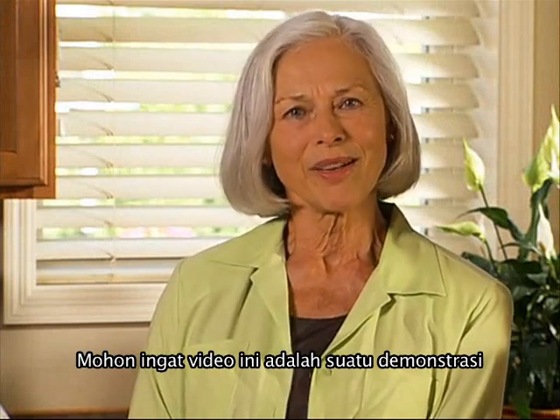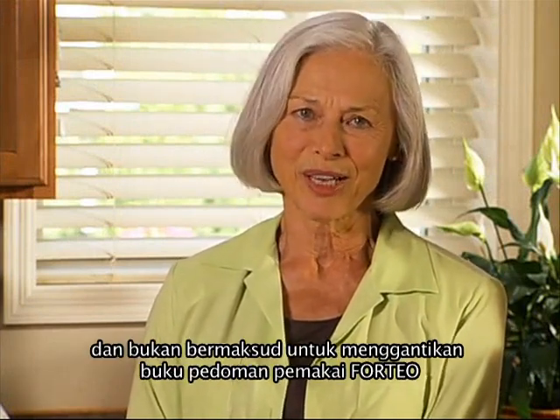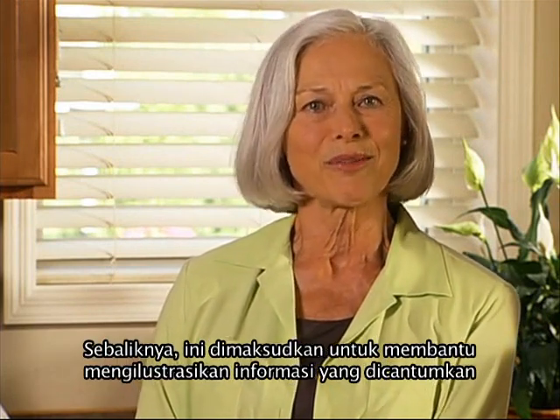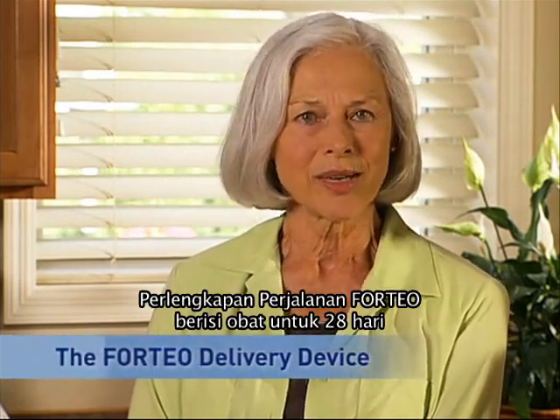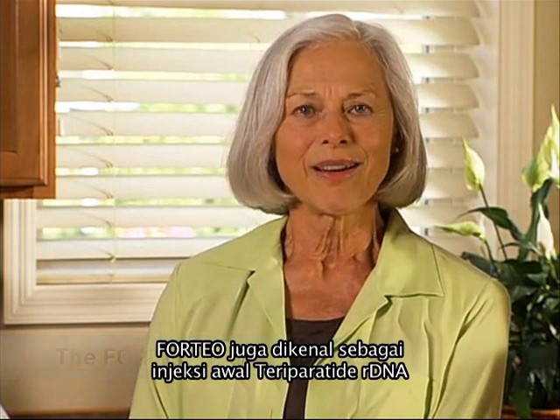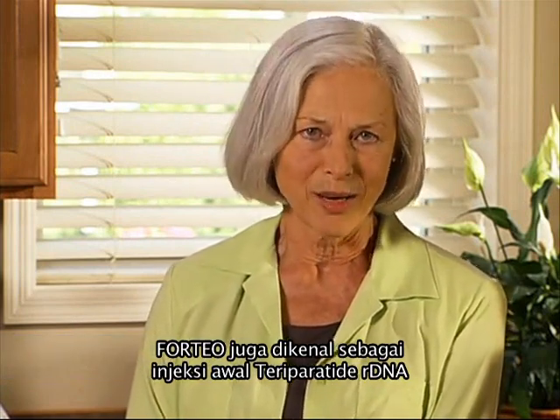Please remember that this video is a demonstration and is not intended to take the place of the Forteo user manual. Rather, it is intended to help illustrate the information found in the user manual. The Forteo delivery device contains a 28-day supply of Forteo in prescribed 20 microgram daily doses. Forteo is also known as teriparatide, rDNA origin injection.